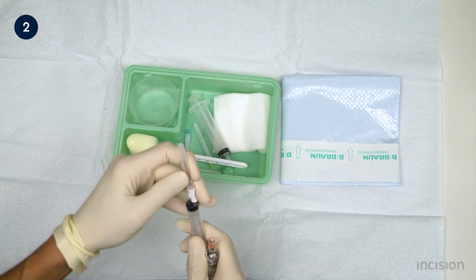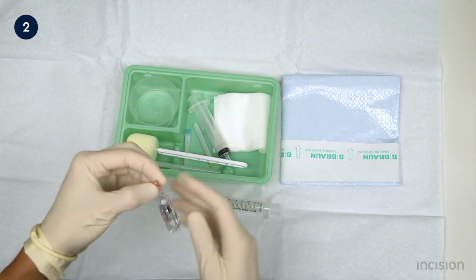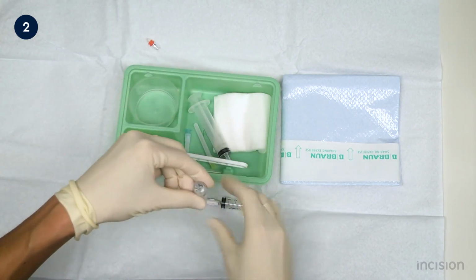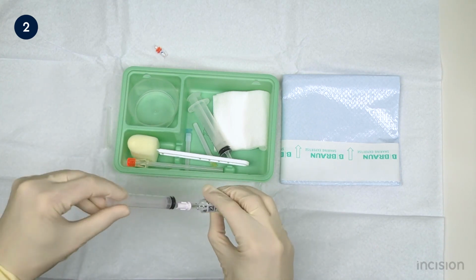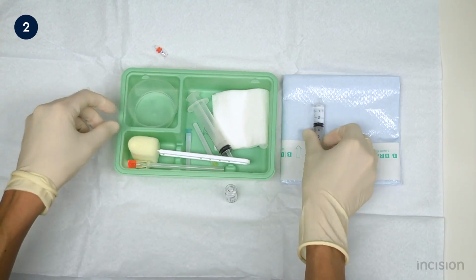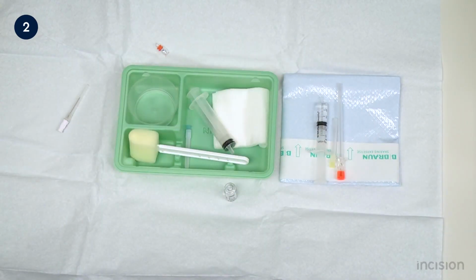It is important to note that the intrathecal anesthetic now highlighted is contained within a glass ampule. To avoid injecting glass into the subarachnoid space, a draw-up needle is used. It has a filter that prevents the aspiration of glass particles into the syringe. Take note that the procedure has a bearing on the type of local anesthetic used. The onset of action, the duration of action, and the baricity of the local anesthetic will now be discussed briefly.